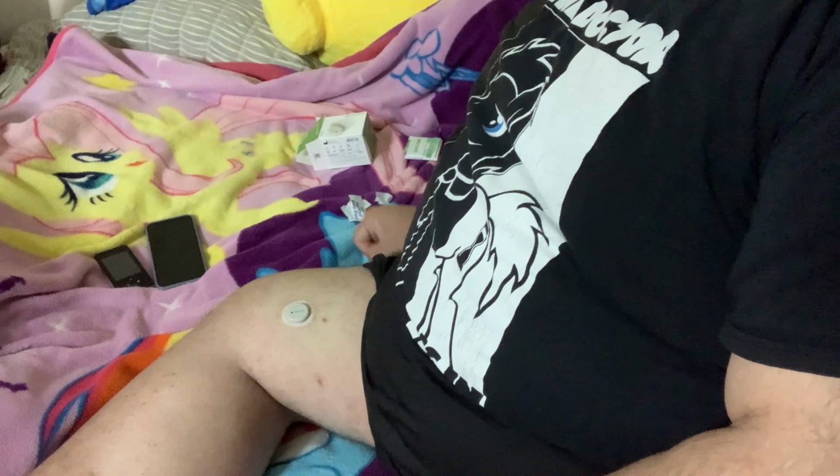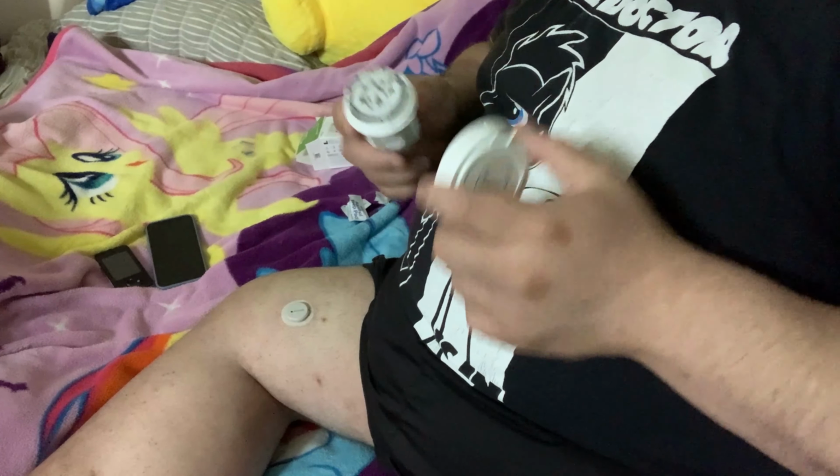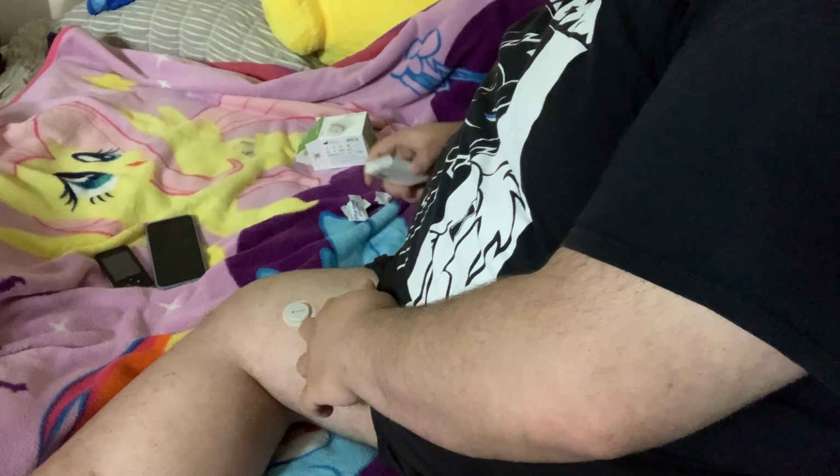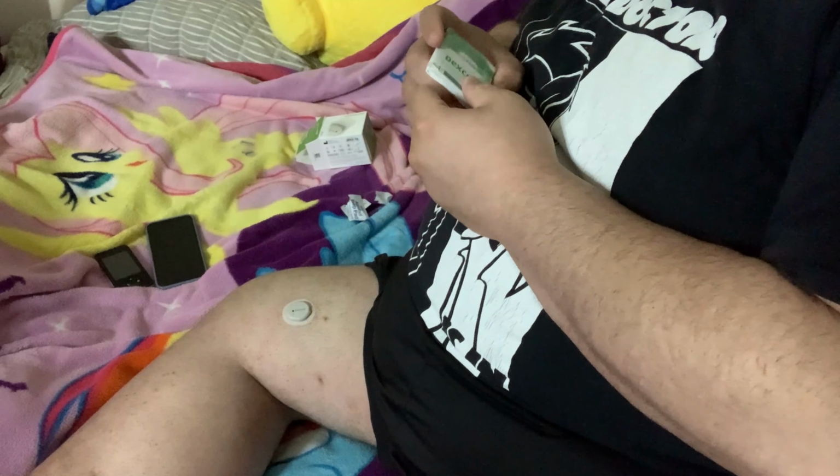It's a simple process. You just stab yourself. Wait for a little bit. And there you have it. Now it's on my leg for 10 more days. And I'm getting new stickers, so hopefully you guys will see the new stickers pretty soon. And then you close it, and then you're good to go. It doesn't hurt at all, I mean, as long as you get used to it.